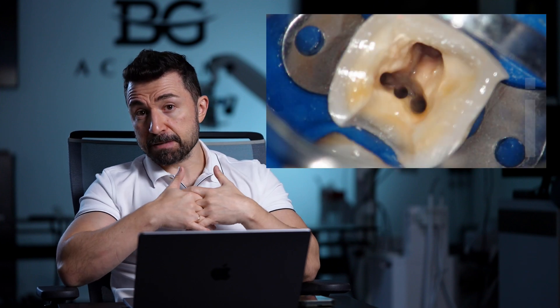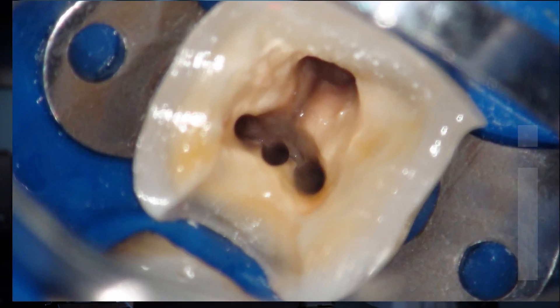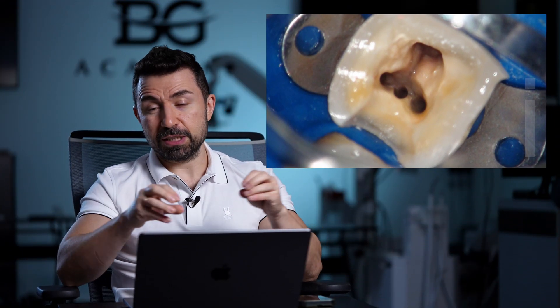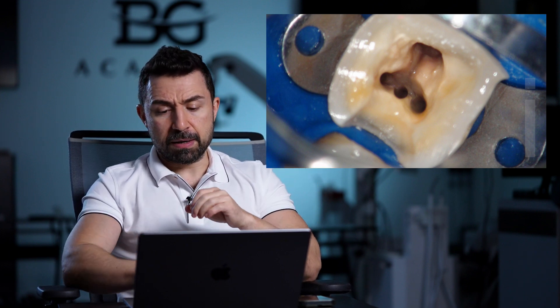I used a rotary thin instrument just to get into this tiny area, and I was lucky to find the middle mesial root canal. This is not very common, but we know we can find these canals in around 30% of lower first molar cases. Even so, I would like to highlight that you must always prep the isthmus to clean it up, because there is always a lot of organic tissue present.